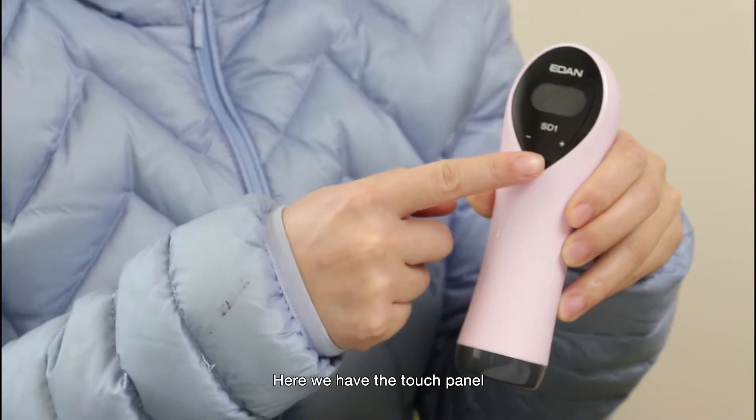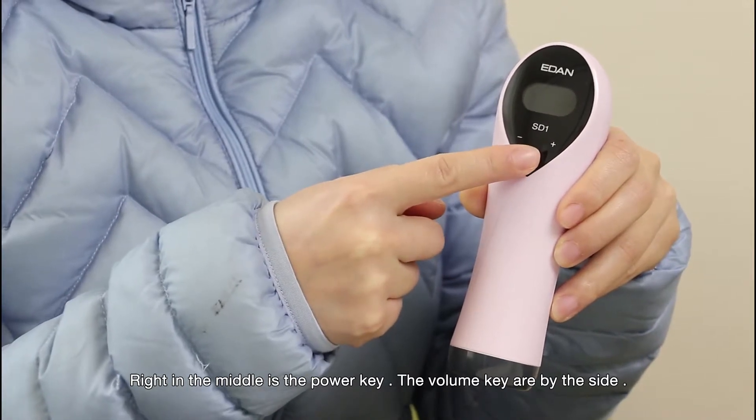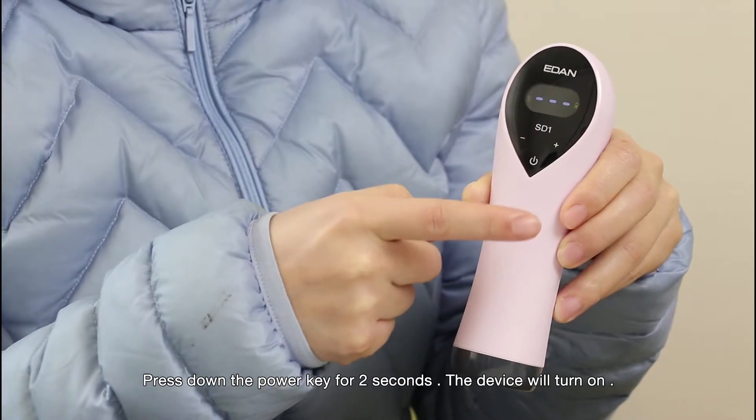Here we have the touch panel. Right in the middle is the power key. The volume keys are on the side. Press and hold the power key for 2 seconds and the device will turn on.